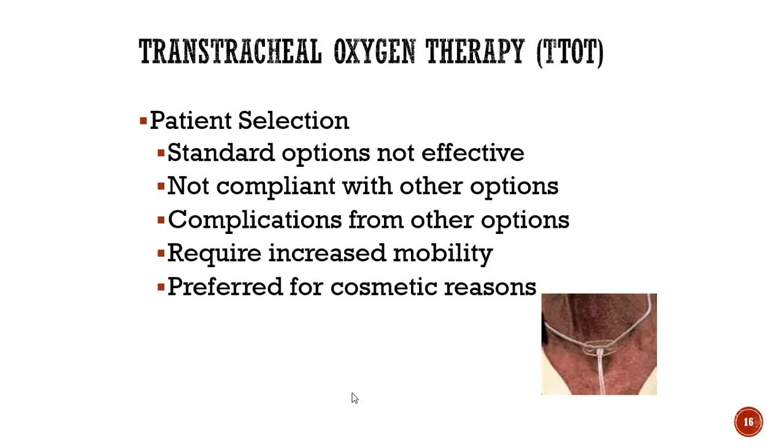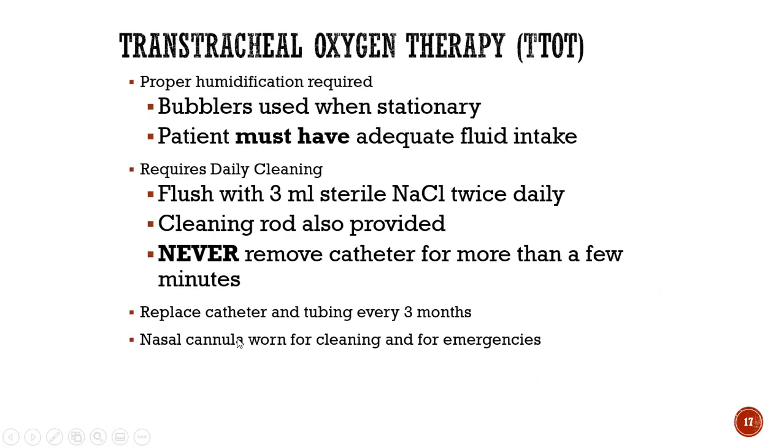Why would anybody pick this? The people that pick this don't like things on their face. They don't want to worry about having to wear a nasal cannula. This is, in their opinion, more discreet and easier with mobility. For cosmetic reasons, they might want this. Like I said, I've seen it one time, but it's nice to know that it's out there.